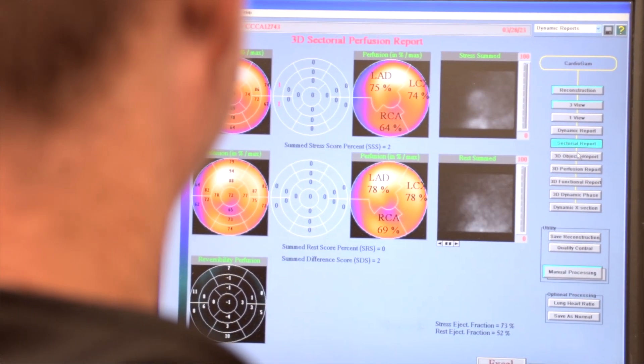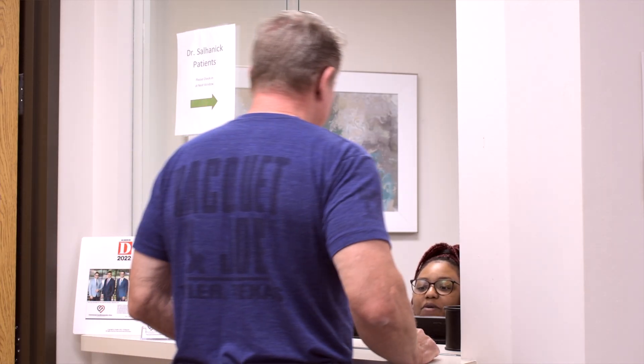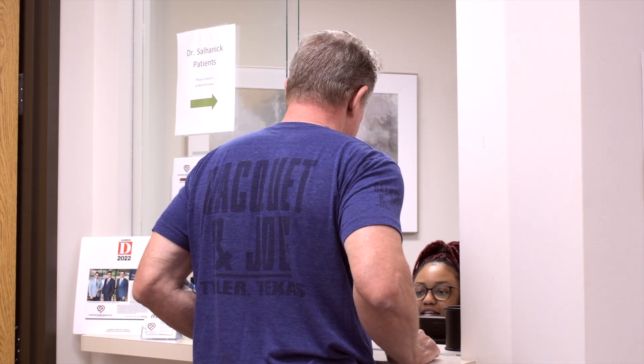The stress test technician will check the image quality before you're able to check out. You should get a call from the medical assistant within 48 hours of the time the test is performed to give you your test results, or you will learn about the results during your next visit.